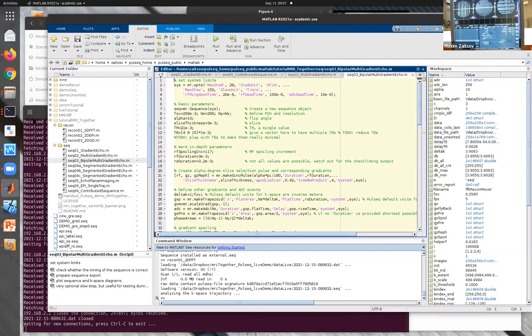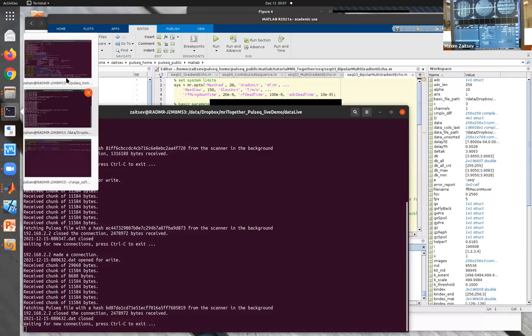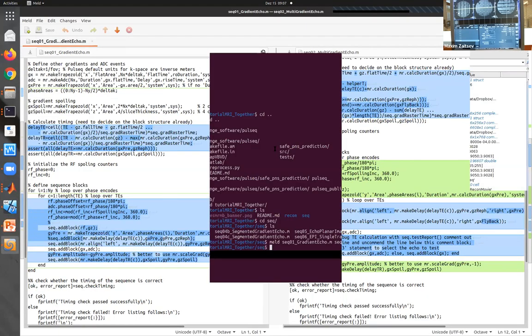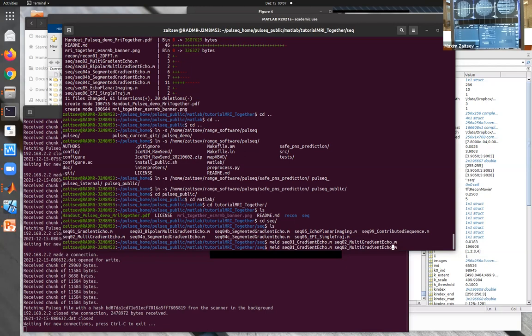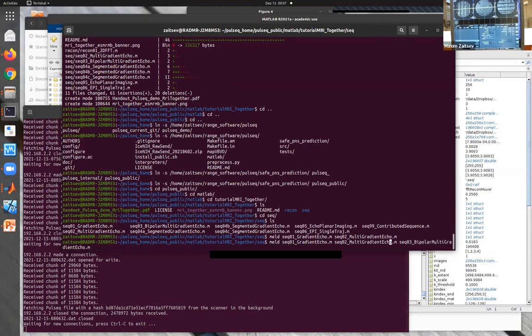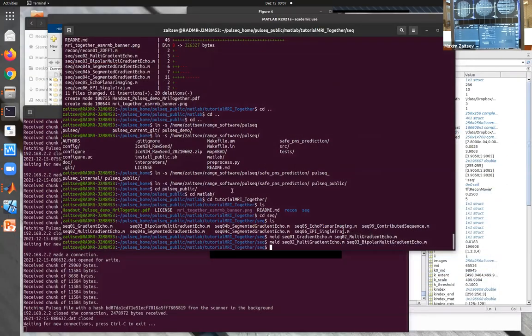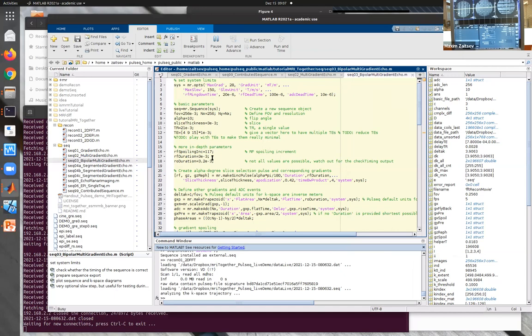Now, if you go and do the next step, you can convert your sequence into a bipolar gradient, so you can get rid of those flyback gradients. And to do that, the sequence actually gets even a little bit more compact. Again, that's just very, very tiny changes which you need to do. Okay, and we can generate the sequence.